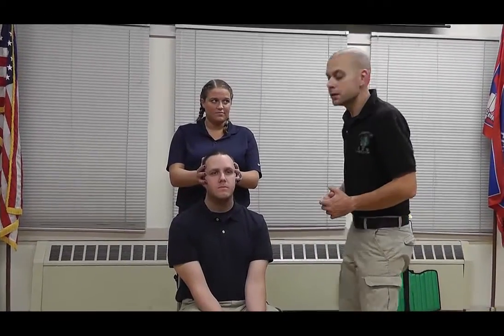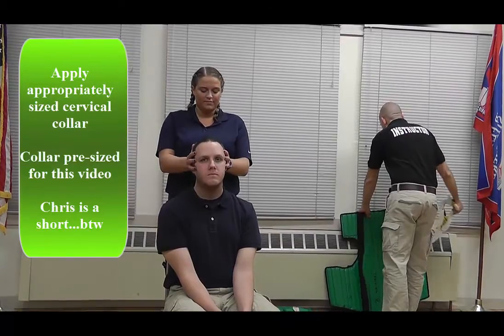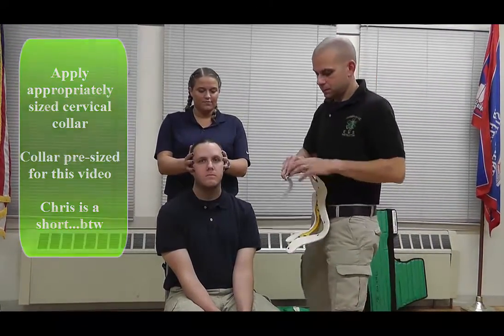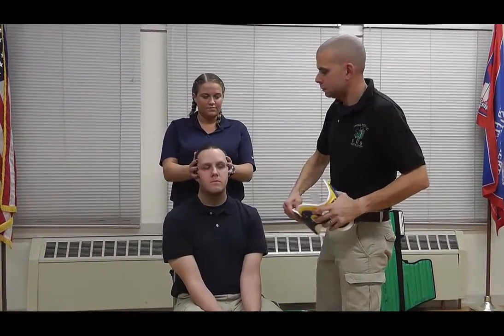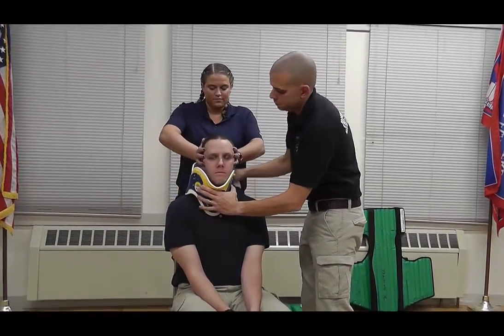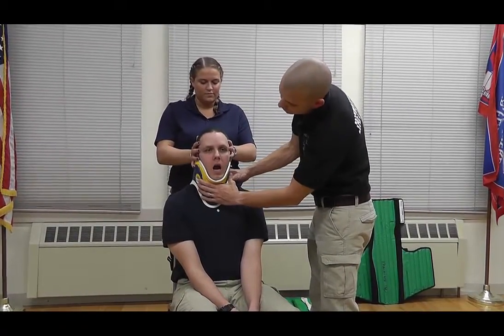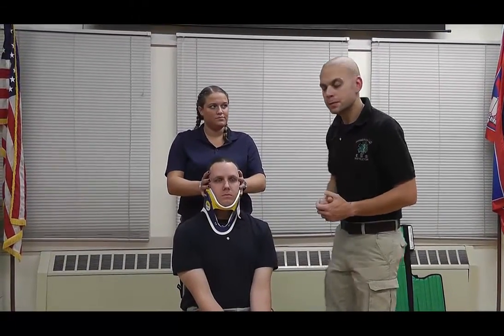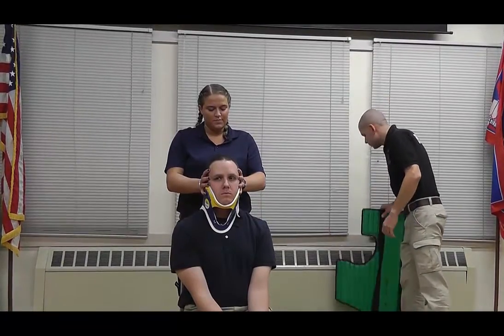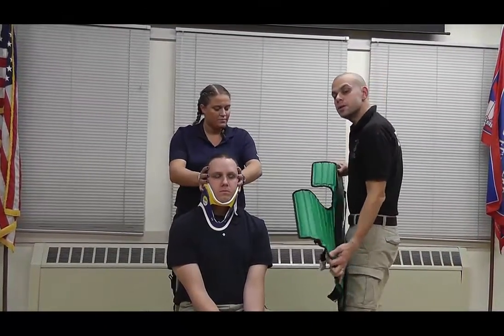Now I'm going to apply an appropriately sized cervical collar to the patient's neck. Open your mouth for me. Good. Next, I'm going to work on getting the device behind the patient's back. I'm going to take the KED and approach the patient from an angle.